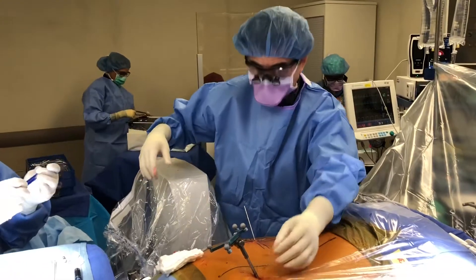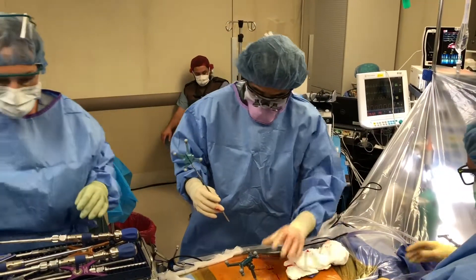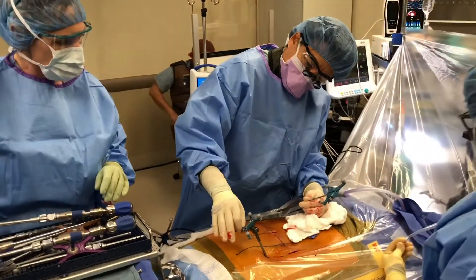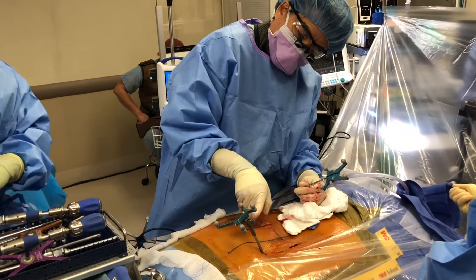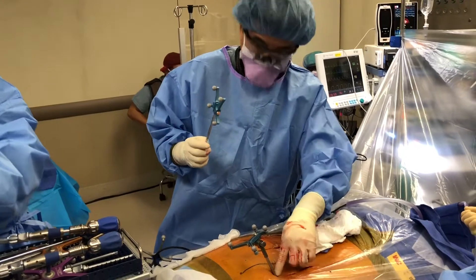That's the first step of making sure your navigation system is working properly. We have the navigation tracking pin in. We've made sure that it's engaged — not perched up in some weird position — and it's in the original spot based on my markings, and it's on a stable stem inside the iliac crest.